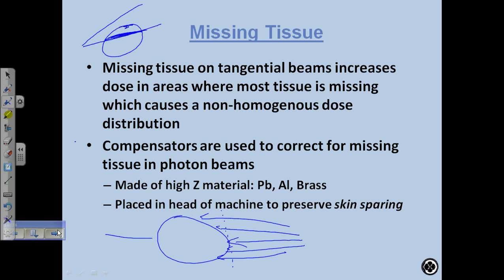So as the beam hits the patient's surface, we know that there's a buildup effect of dose where this area here, right in the area shallower than Dmax, gets less dose than Dmax. Okay. And that buildup effect looks like that, right? There's the PDD. So this buildup region right here, this area here has lower dose than Dmax. Okay. So we call this skin sparing because we're sparing some of the skin right at the surface.